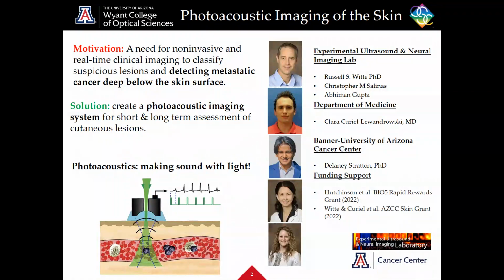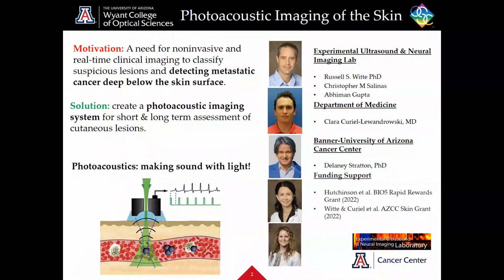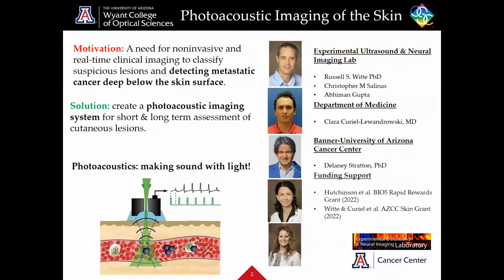Other imaging modalities such as traditional pulse echo ultrasound can provide this up to a centimeter deep. Really, they don't provide anything in terms of material specificity, so we don't know exactly what we're looking at in terms of the constituents. We only have the structure that the ultrasound can provide.